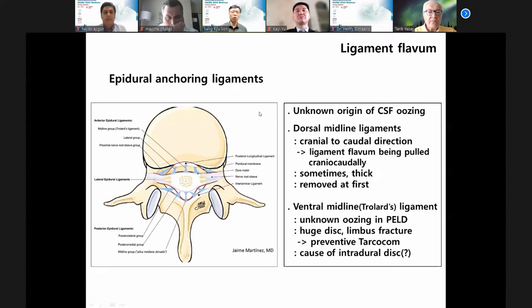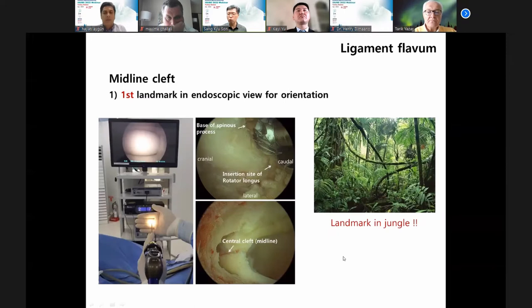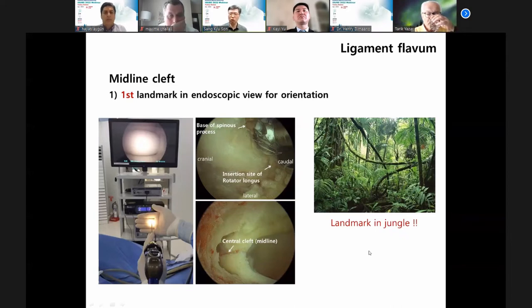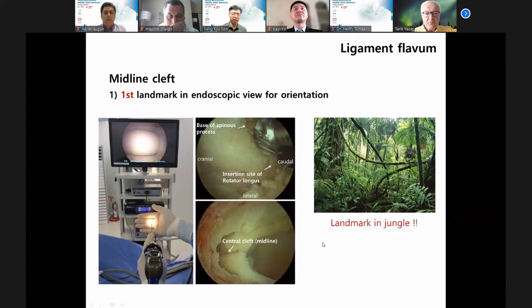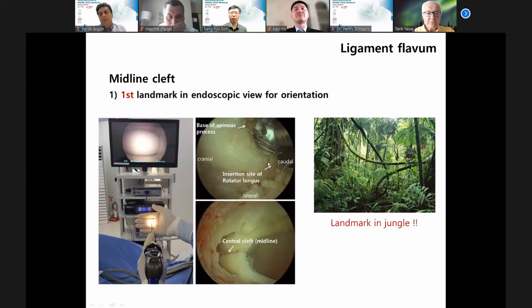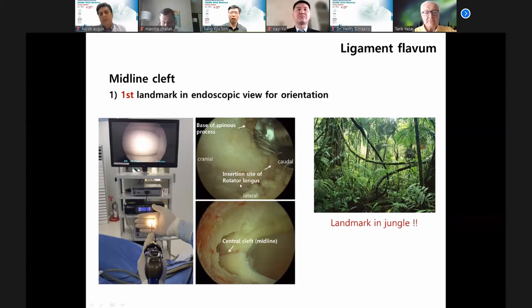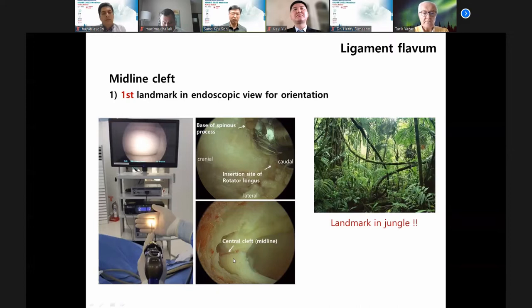Next: midline cleft. I always emphasize orientation — if you go into a jungle and have a definite landmark, you can find your destination. But if you lose the landmark, you may wander. UBE surgery is the same: before surgery, orientation is important. You need to make a definite landmark. The first important landmark is the endoscopic view for orientation — the base of the spinous process and insertion of the rotator muscle. After removing some bone, the midline cleft is the first important landmark.